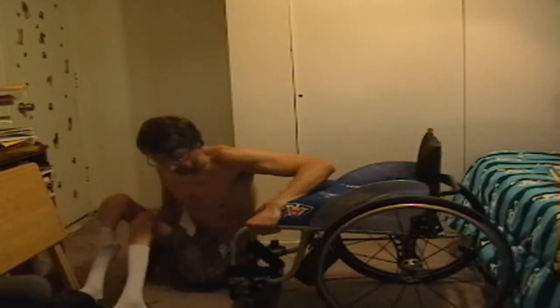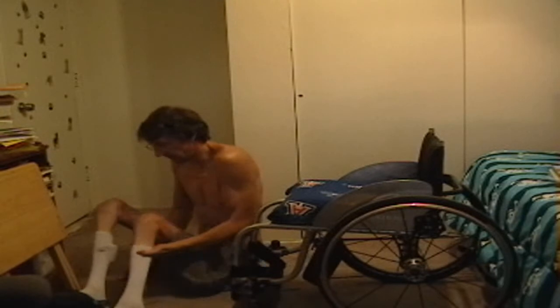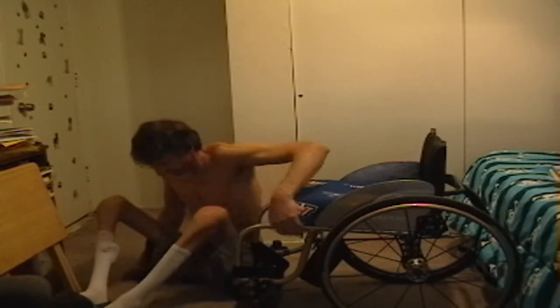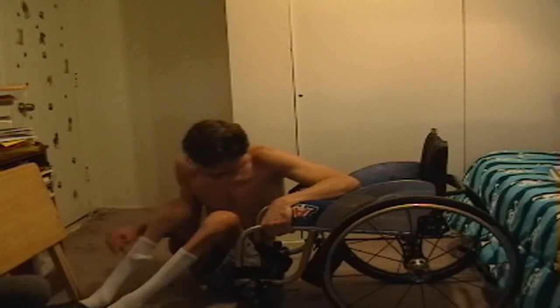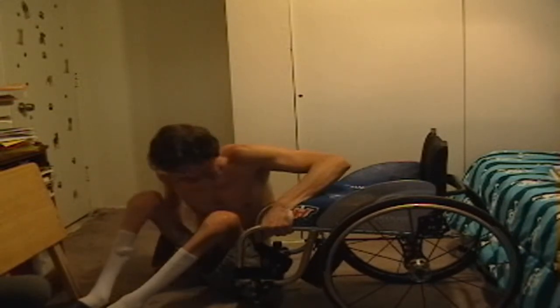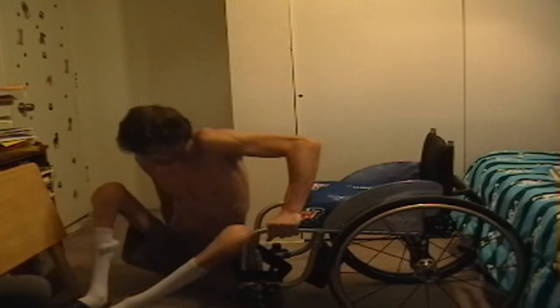I get my wheelchair against something stationary so it's not going to go anywhere. Then I put my right hand in a fist and my left hand grabbing onto the wheelchair frame to begin the transfer.